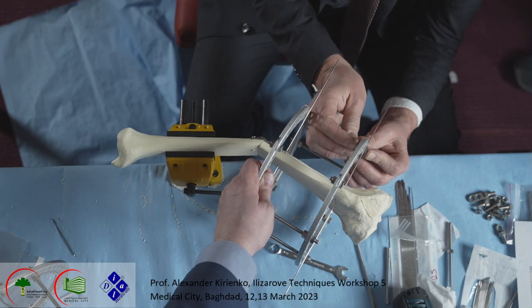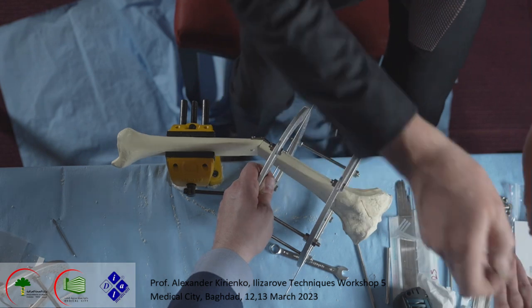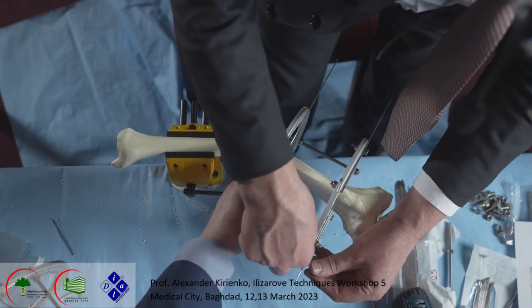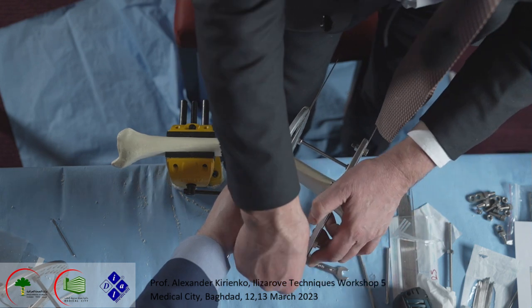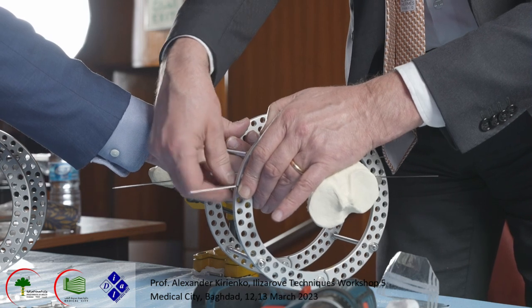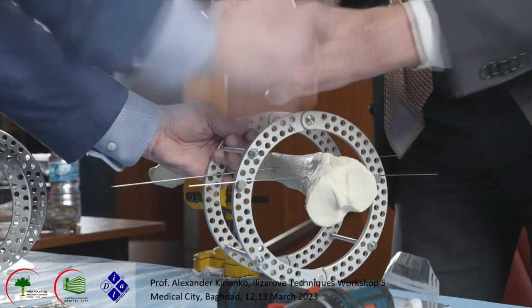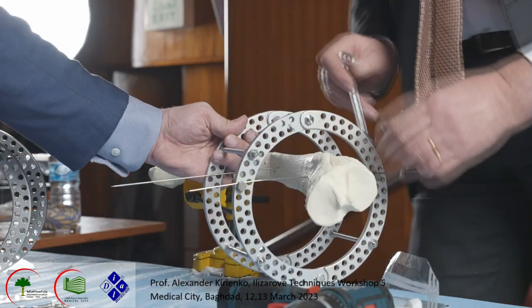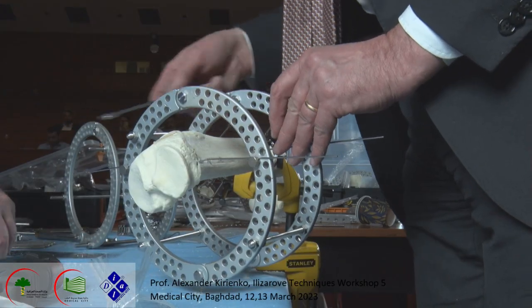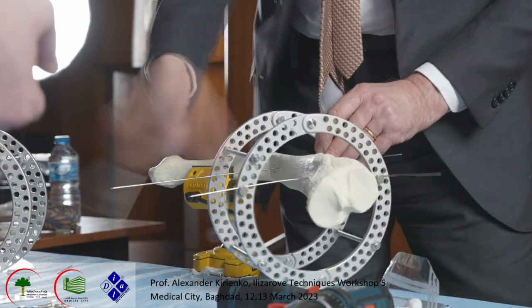Okay, one. Center it like this. Touch it. Okay, so it's a little bit medial. We may shift it a little bit like this.